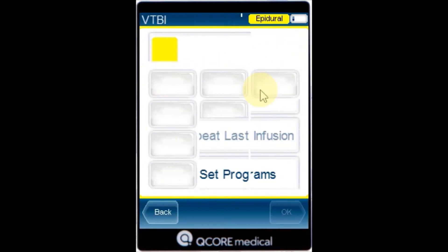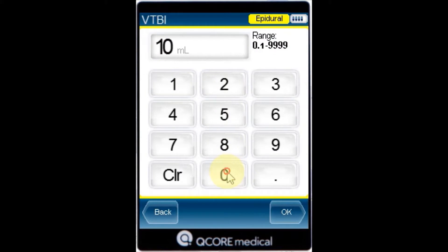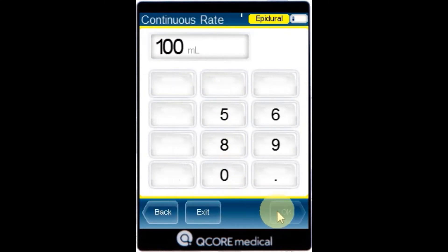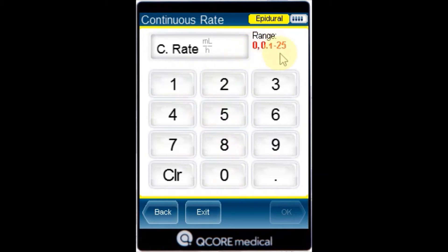Using the keypad enter the VTBI value and press OK. Using the keypad enter the continuous rate value and then press OK. Note the applicable continuous rate value can be set to zero.